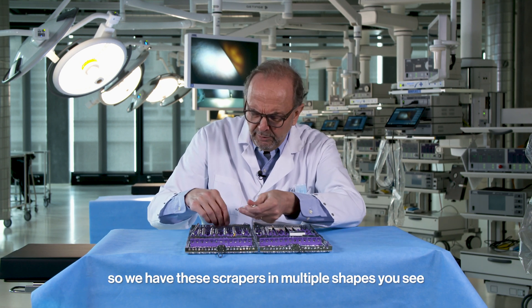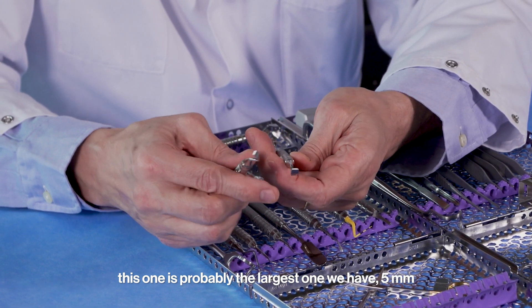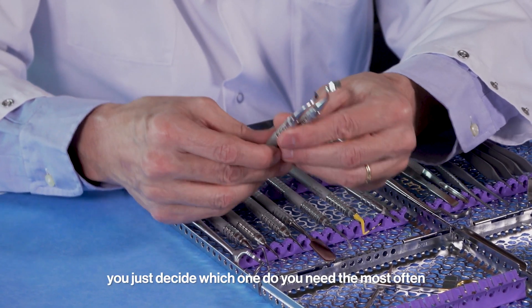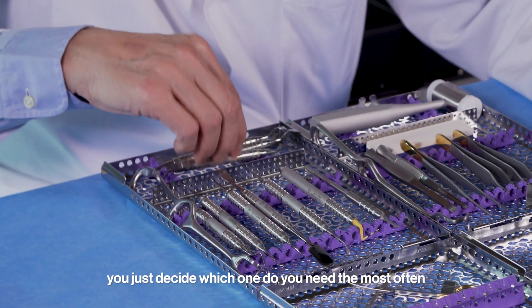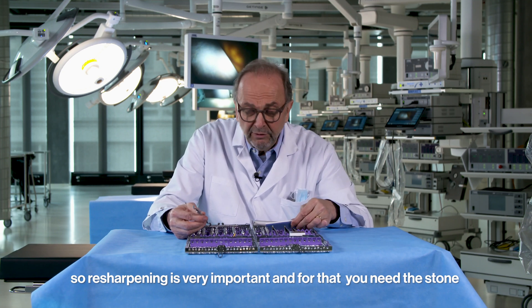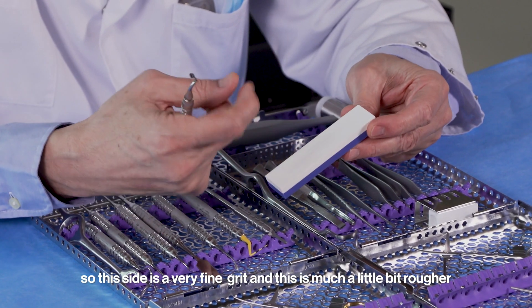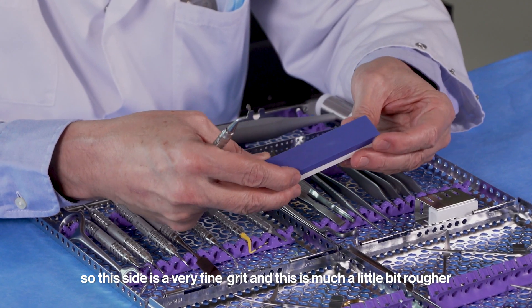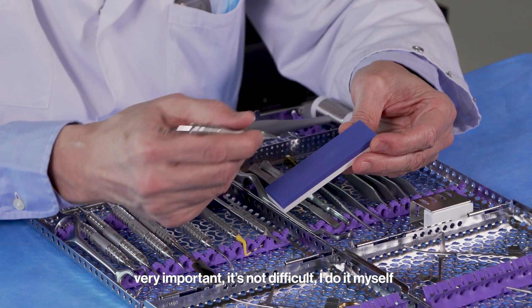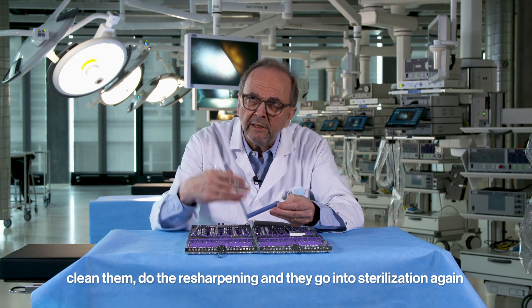Resharpening is very important. For that, you need a stone — this one has two colors: one side is a very fine grit, and the other side is a bit rougher. I will show in a separate video how we do it; it's not difficult. I do it myself, sometimes right after surgery — clean them, resharpen, then they go into sterilization again.